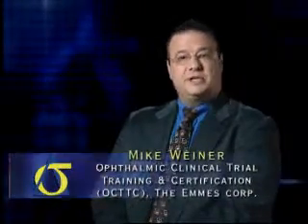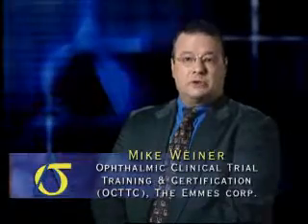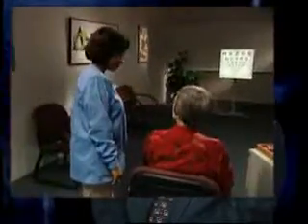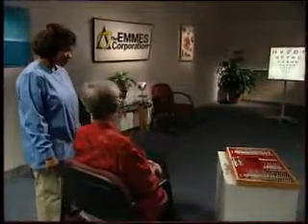The following presentation is going to familiarize you with the basic guidelines for assessing a subject's visual acuity according to the ETDRS protocol as modified for the Age-Related Eye Disease Study, also known as AREDS. For the purposes of this training, we will assume you have already identified and set up your visual acuity lane and you've completed your refraction.